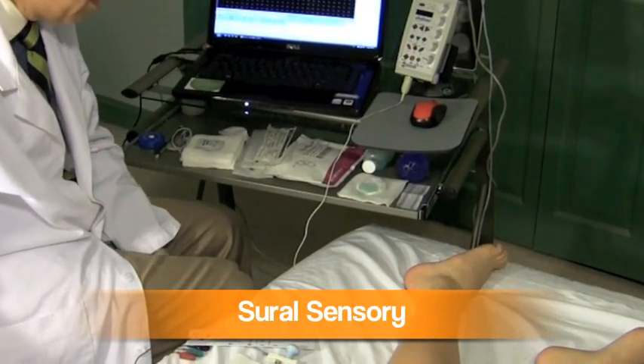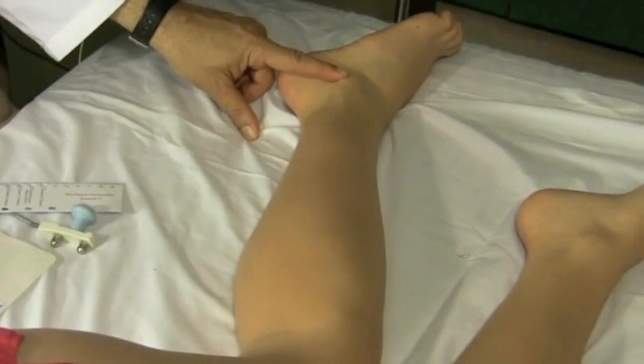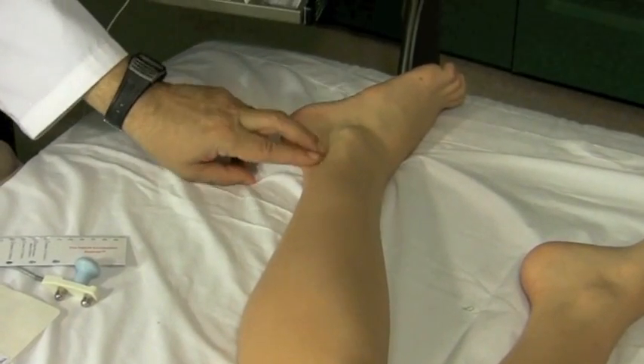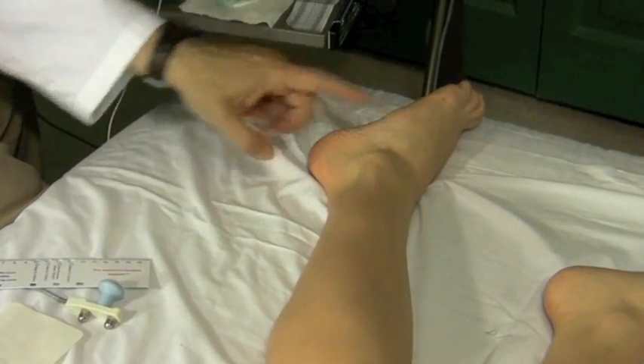I like to start with the sural nerve. The sural nerve is right behind the malleolus, right behind this bone. It comes down from the calf, curves around it, and goes around the foot.